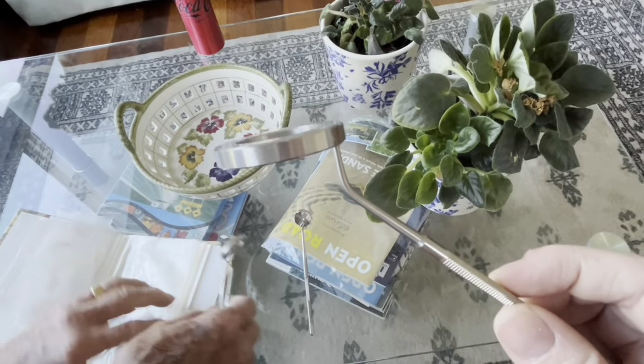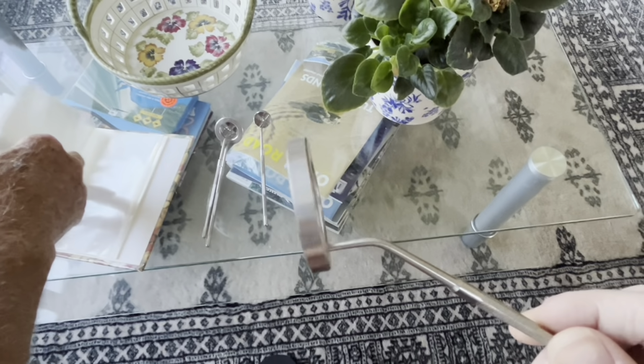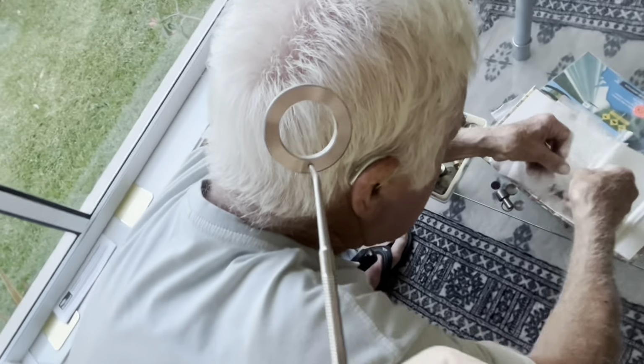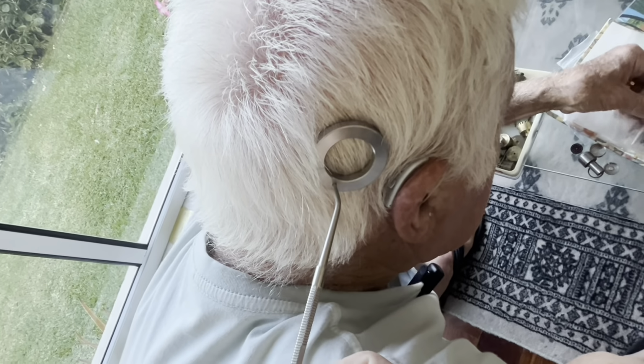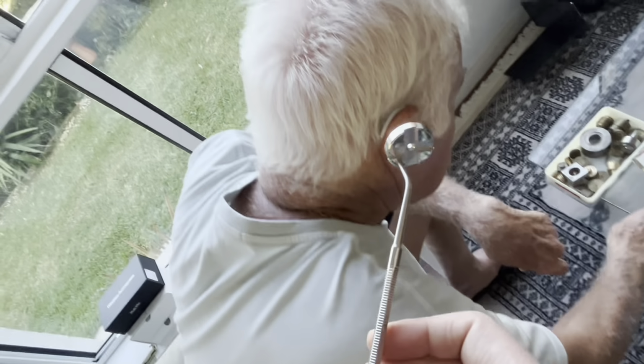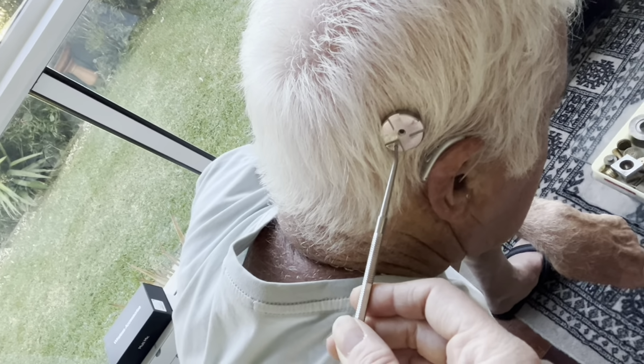It's a long time. And you didn't just make components for the implant itself, did you? You actually made some of the surgical components too. Yeah, I did some work on the surgical tools. There was one that was like a ring, and they put that against you. They drew a circle, and then they took a skin flap off, and then cut a hole in the, I think it's the mastoid bone behind the ear. And then there was another one that they had to grind a hole, make this hole in the bone. And there was another tool that was just a round disc on a handle, and once that fitted into the hole that they ground in the bone, they knew the implant would fit, so they popped it in there and connected.